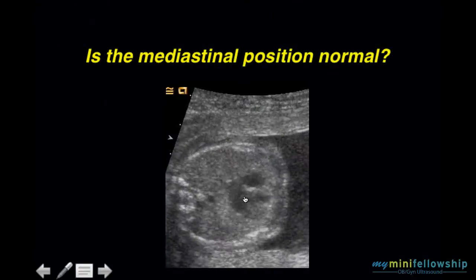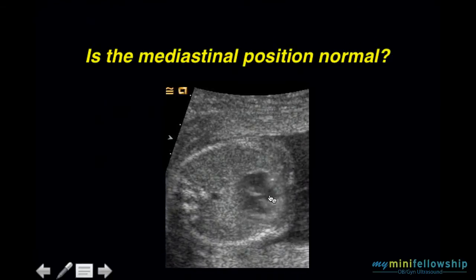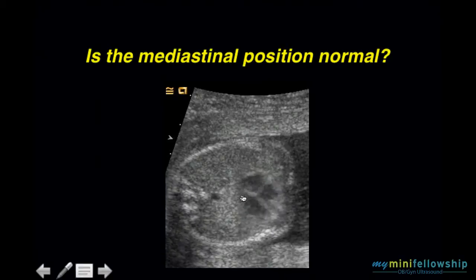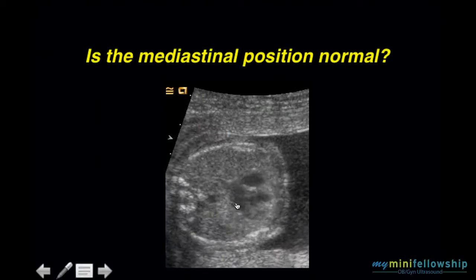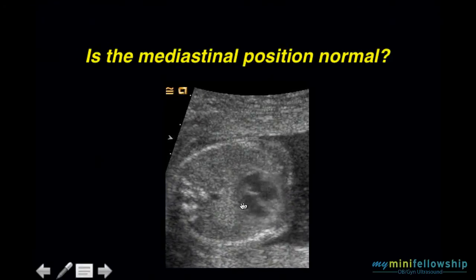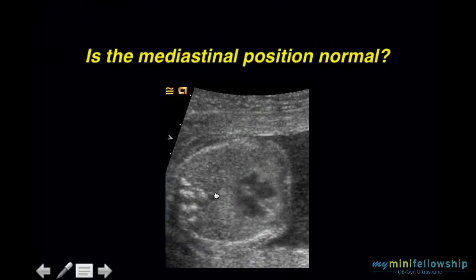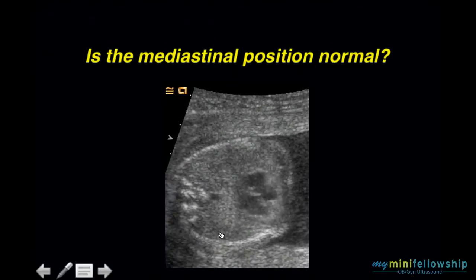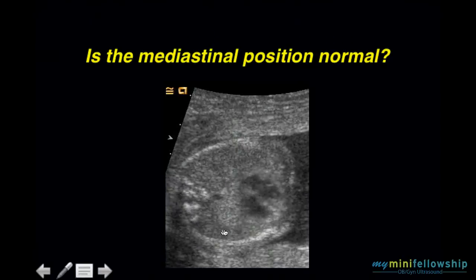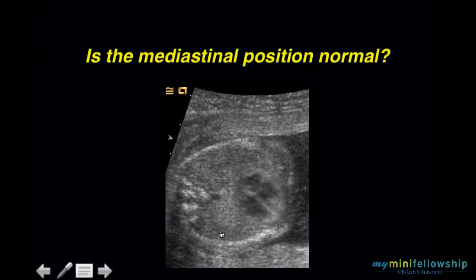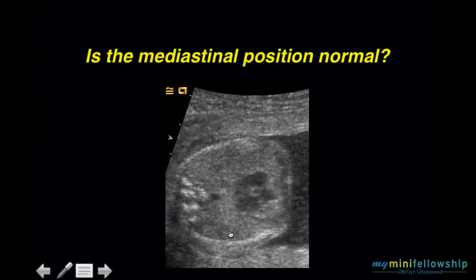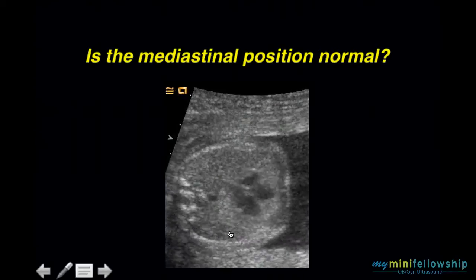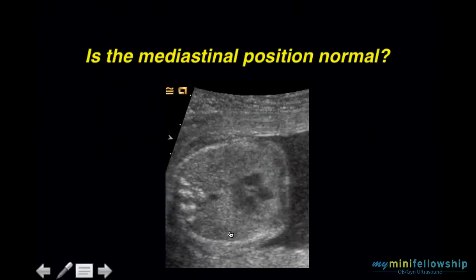Spine, descending aorta, left atrium, left ventricle, right ventricle, right atrium. It is not until we recognize that the left atrium and the descending thoracic aorta are separated that we actually have a fighting chance to recognize the small sequestration that has interposed itself between the aorta and the left atrium, causing an anterior mediastinal shift.